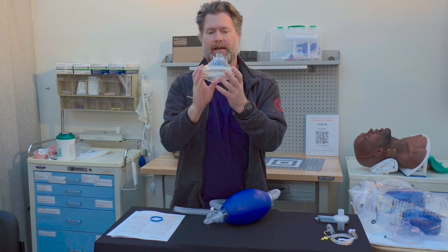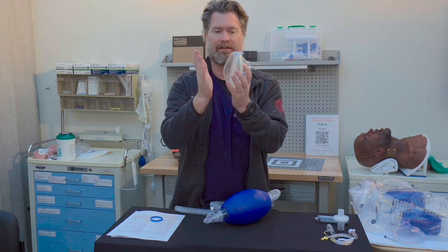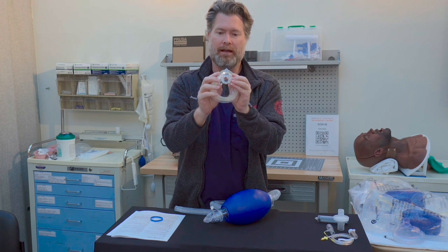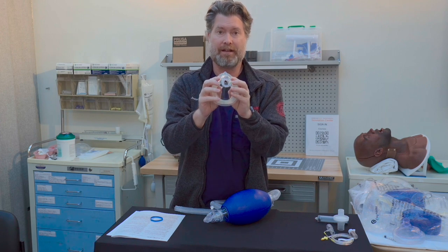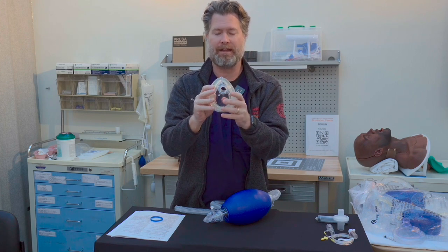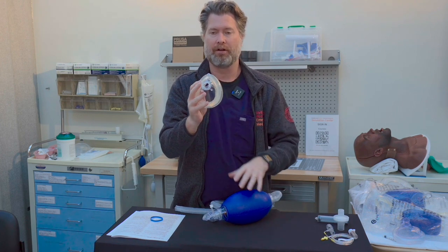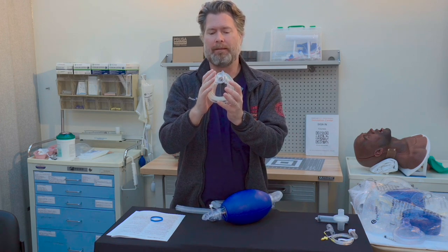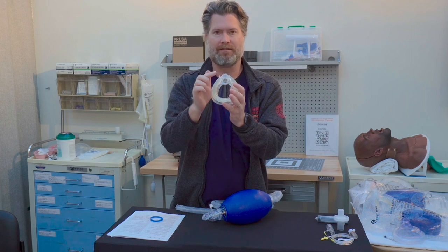Finally we get to the mask. Most people think about the seal and how it connects to the bag and stop there, but there are a couple of other features that I think are very important. This one has small strap connectors so that if you achieve good oxygenation and ventilation, you can put a strap around the mask and around the back of the patient's head to be hands-free — you just have to use the bag without needing someone else to hold the mask or trying to hold it with one hand and the bag with the other. It's not something we use often in the emergency department, but for transport in EMS or in the OR, this is incredibly useful.